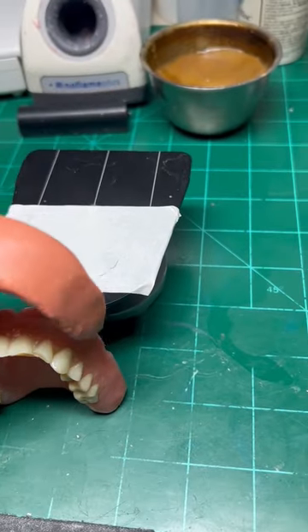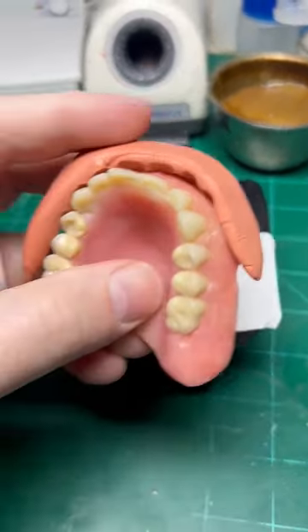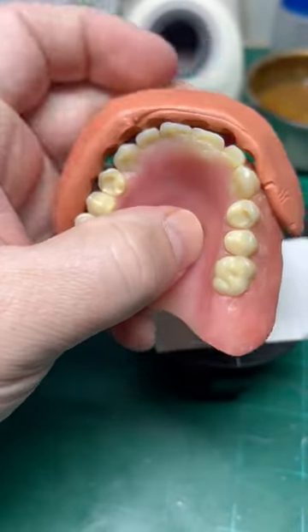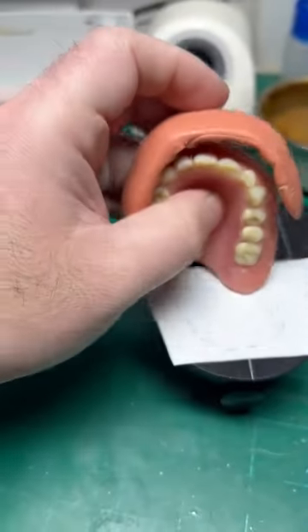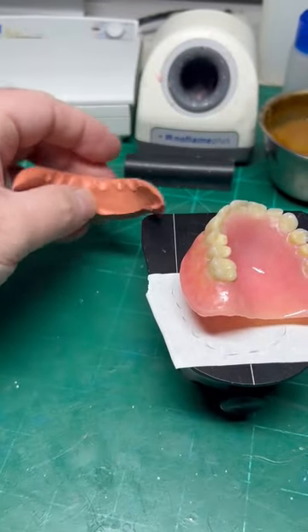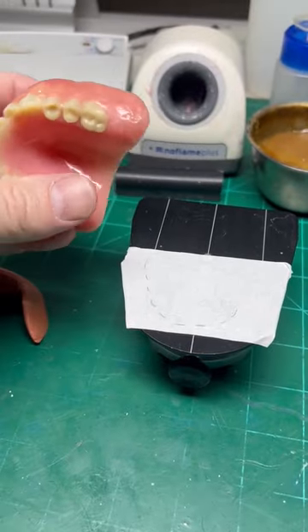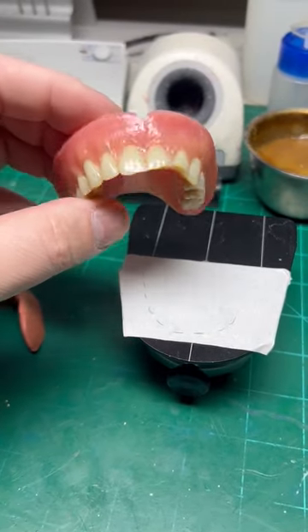So now we have finished the matrix. We now have a position of the teeth that we need to approximate facially. This is really hard to do with one hand, but you guys get the idea. So this is for the facial, this is for the incisal. When I'm positioning the teeth, I'll know where to align them, at least approximately.